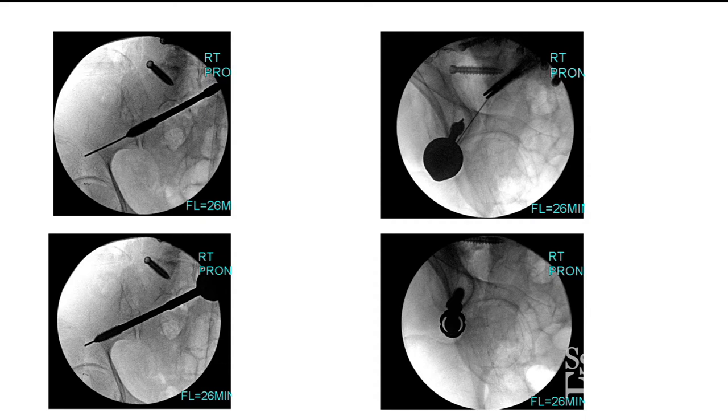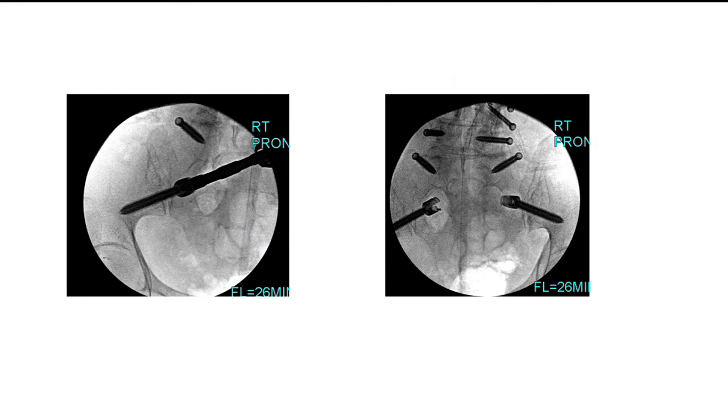Using the same percutaneous technique, you put a guide wire, then tap. As Tyler mentioned, if you don't really tap, you can break screws — it's the same principle here. You really have to tap through and through, always trying to stay inside the teardrop.